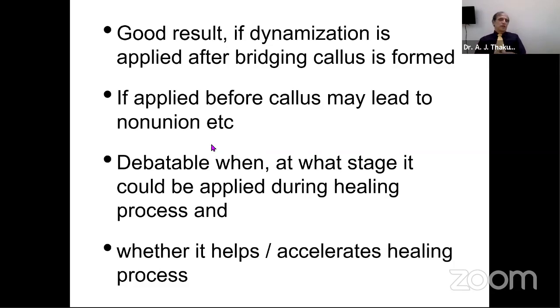What stage this could be done is debatable, and one can argue on both sides. One has to use his judgment and a little bit of luck, and then proceed with dynamization. Whether it helps, and at what time it helps, is still wishy-washy.